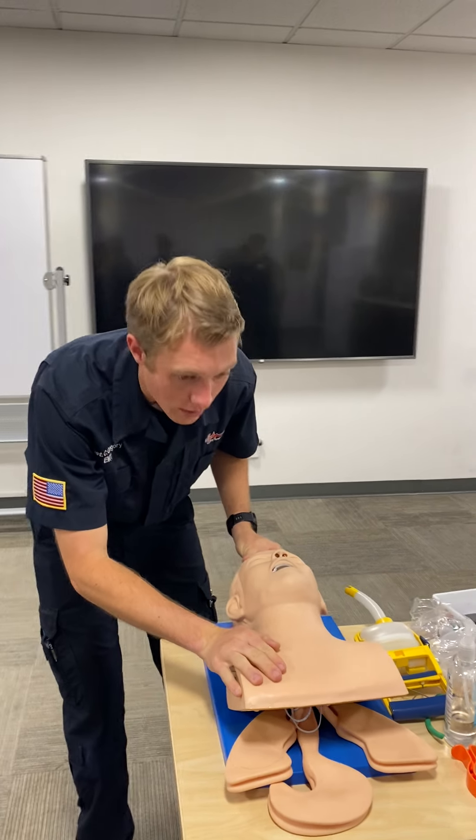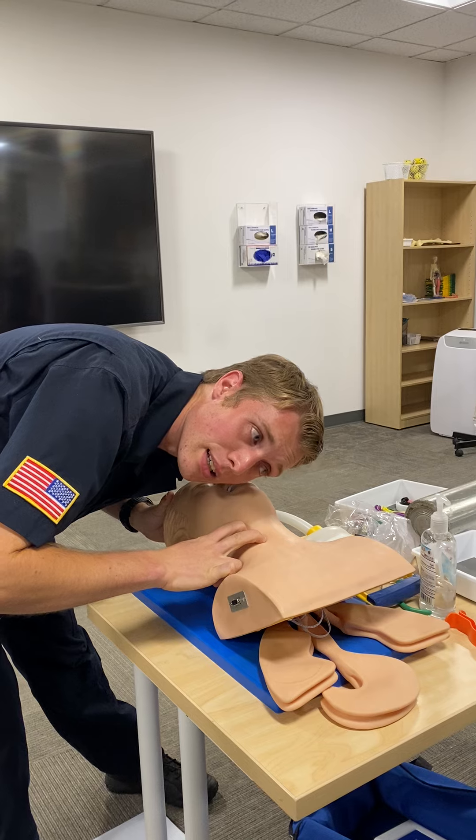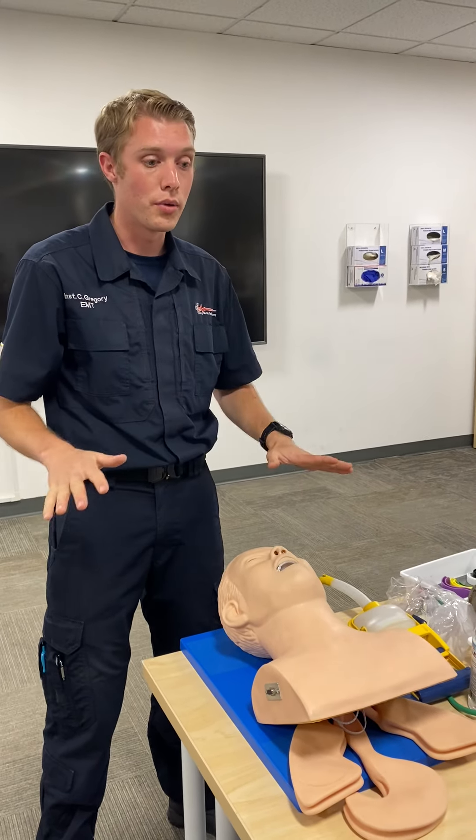Checking level of consciousness: hey, hey, are you okay? No response. Immediately checking pulse and breathing for at least five but no more than ten seconds. The preceptor informs us there is a pulse, about one per second, but there is no breathing.